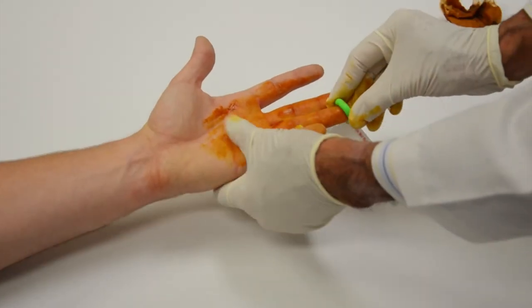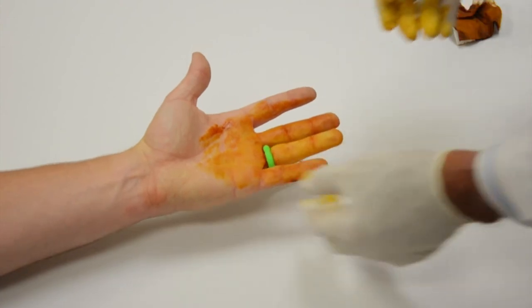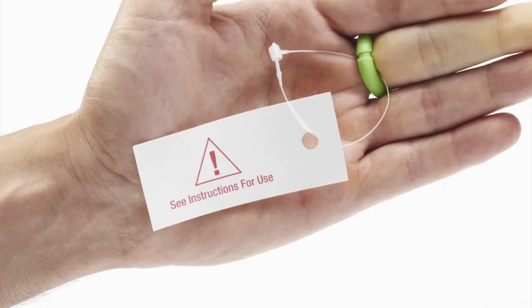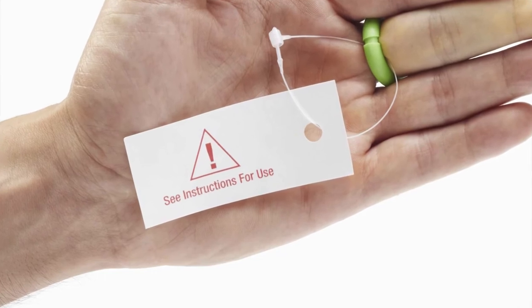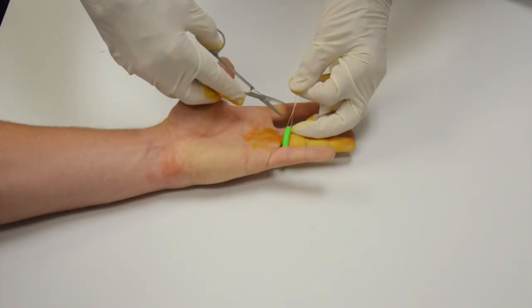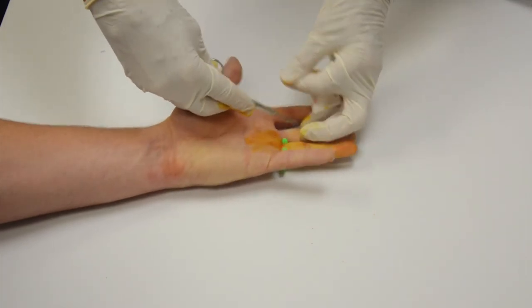The tourniquet glides over even significant wounds with blood or betadine in the field. Leave the tag on as a reminder and use the tourniquet for no more than 90 minutes. To remove, simply pull the tag upward and cut the tourniquet using scissors or a blade.